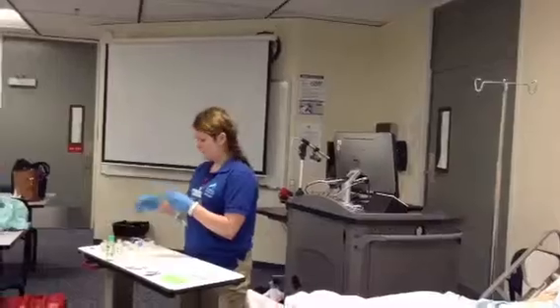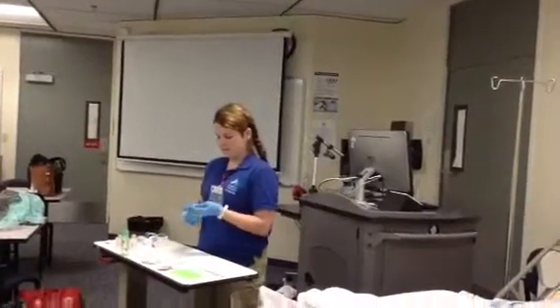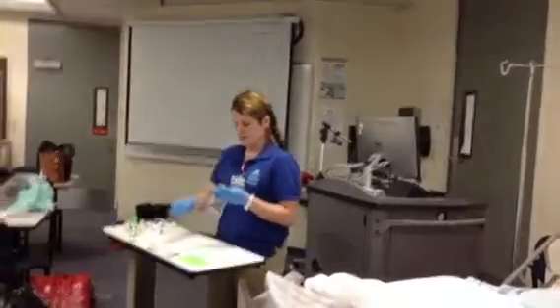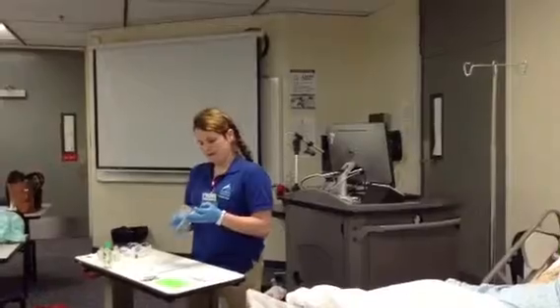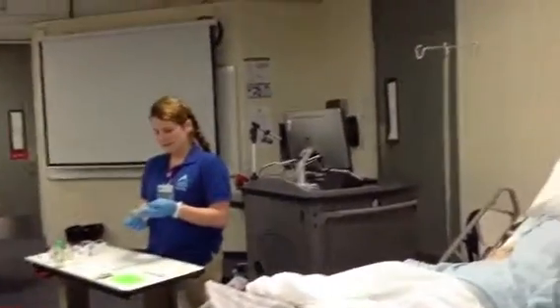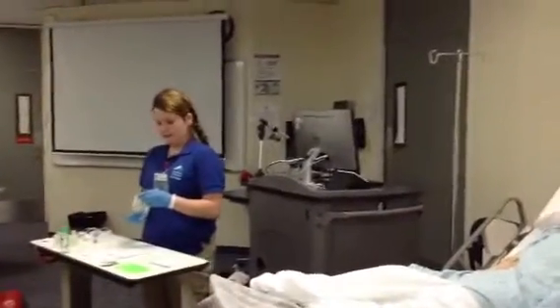And this would go in sharps. I'm going to gently mix it. I'm going to add my label to the back, and that's going to include the client name, drug, dosage, time, and my initials, and the date.